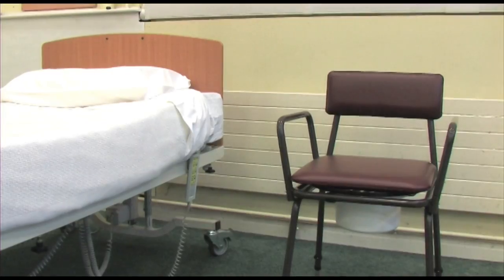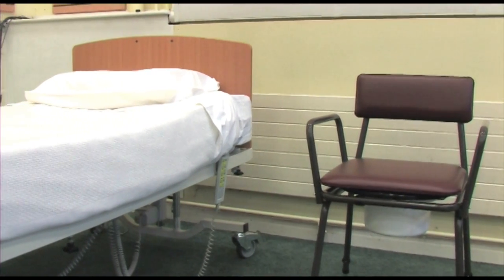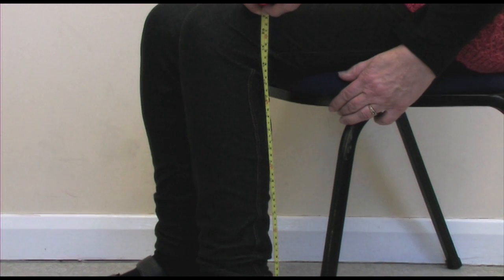If you have difficulties getting to the toilet, you may find a commode chair useful. Some people have these in their bedroom for use at night, or in a suitable location downstairs. In this short tutorial, we'll show you how to use this piece of equipment.